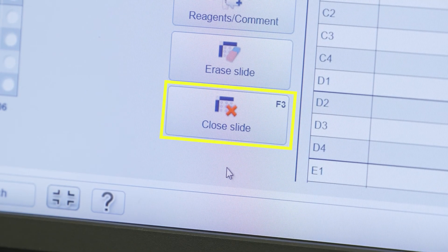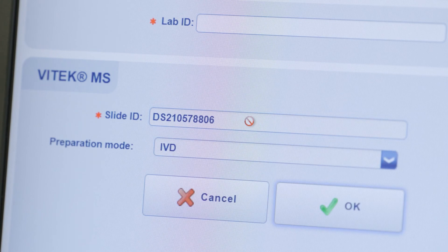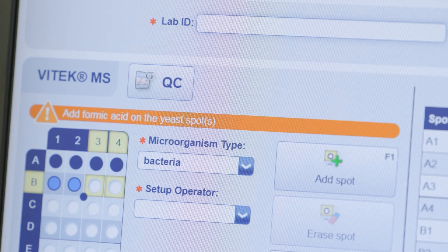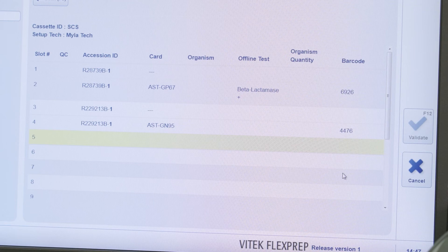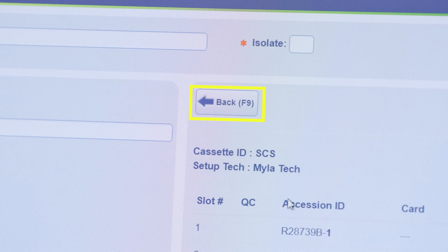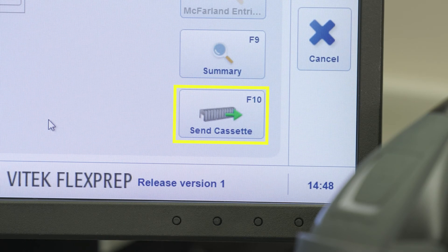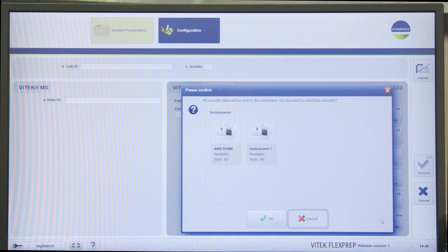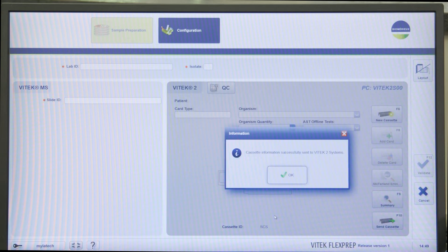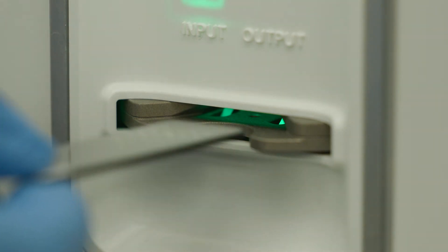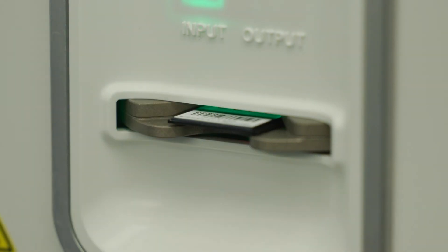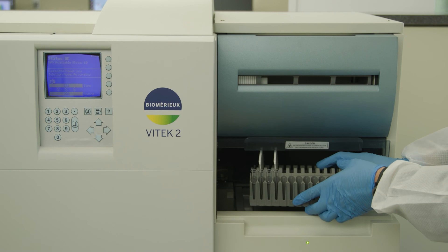When all desired spots are linked to the lab ID, click Close Slide or F3 to exit. It is also possible to reopen the slide for later completion of the acquisition group, providing it has not been acquired. Click the Vitec 2 Cassette Summary icon. The Cassette Summary can be viewed to verify cassette accuracy before sending cassette information. After verifying accuracy, click the Back button to return to the previous screen. Click Send Cassette after entry and verification of all isolate data. Click OK to send the cassette data, then click OK again. The prepared slide can now be loaded on the Vitec MS or Vitec MS Prime instrument provided all spots on the slide are dry. The prepared Vitec 2 cassette is now ready to be loaded.